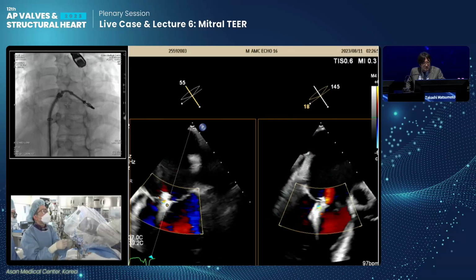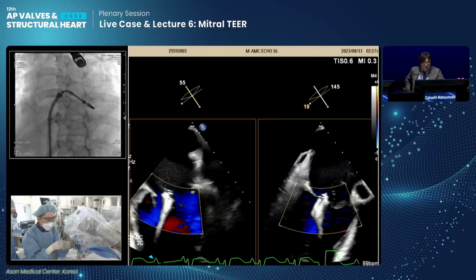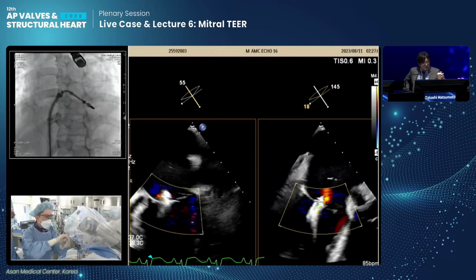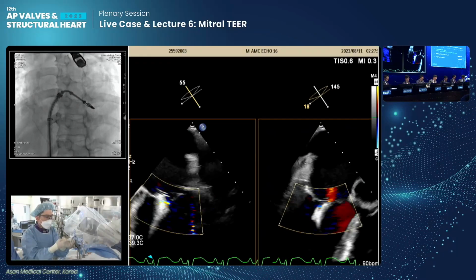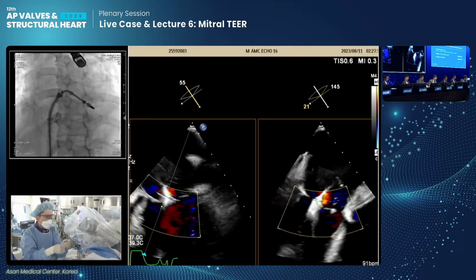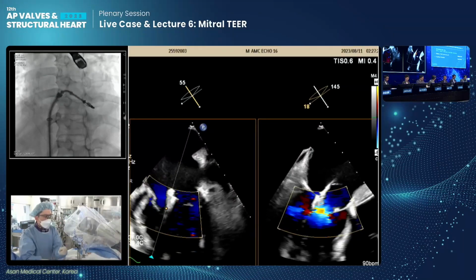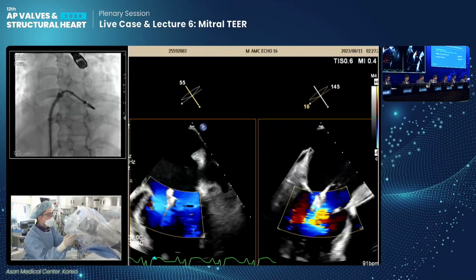What is the blood pressure right now? It's 113. We are using dopamine. But his usual pressure is 80, right? Yes, 80 or 90. Okay. The line is so smooth. Looping. Very straightforward case. And check the clip. It's okay.